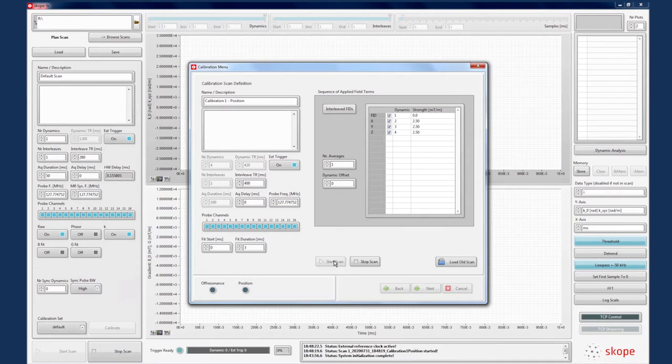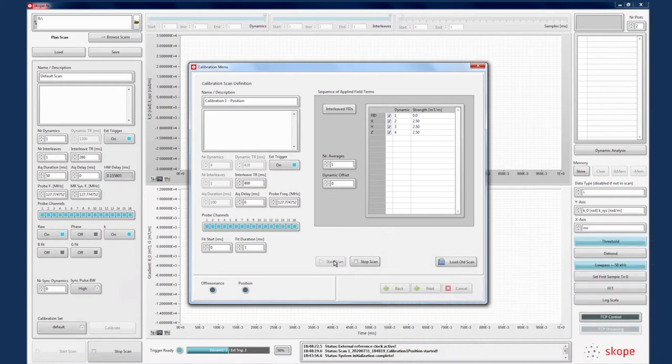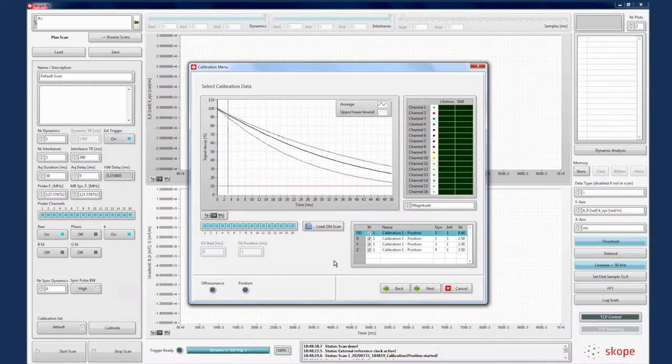Once the LED light appears, we can scan the calibration sequence on the MR scanner. Notice the progress bar incrementing with each TR. After four acquisitions, we see the scope system post-processing the data and showing an analysis of data quality. We can see the average and boundary FIDs on the left with indications for probe SNR and lifetime on the right.